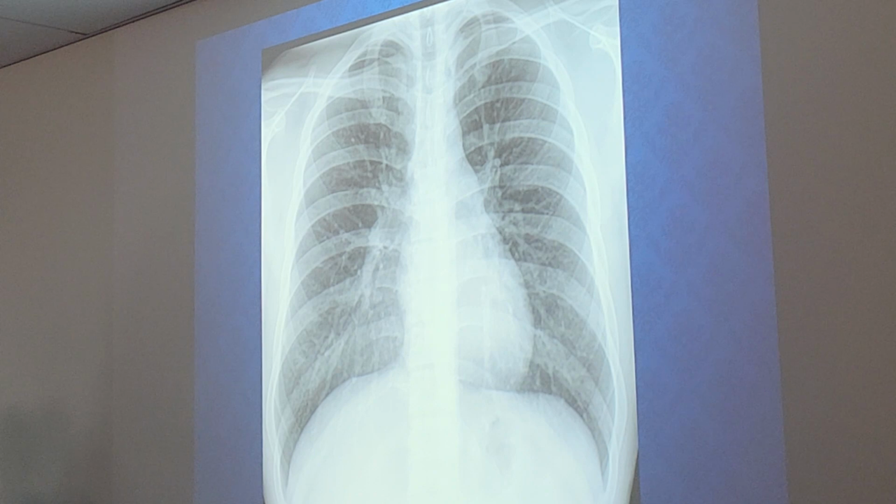Just coming back to Jay's question real fast. You asked about the marker being placed PA on the PA chest, right? Yes, sir. So was this marker placed PA? It doesn't look like it. So what would a PA marker look like? Backwards. Okay. Was this patient PA?